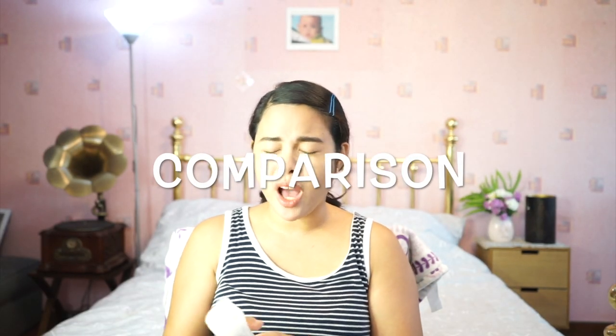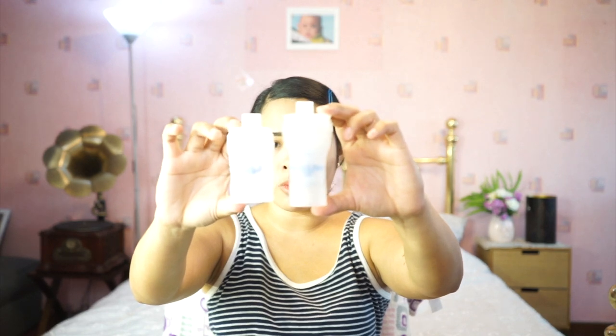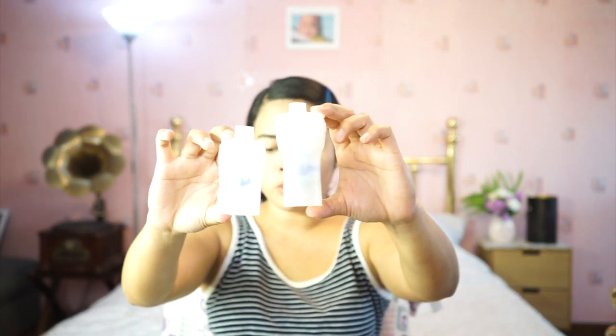To show you how silent it is, I'll do a side-by-side comparison with our previous Omron nebulizer. In my left hand is the old one, and in my right hand is the new one. The old one is a bit dirty since it's been with us for about 7 years or more.